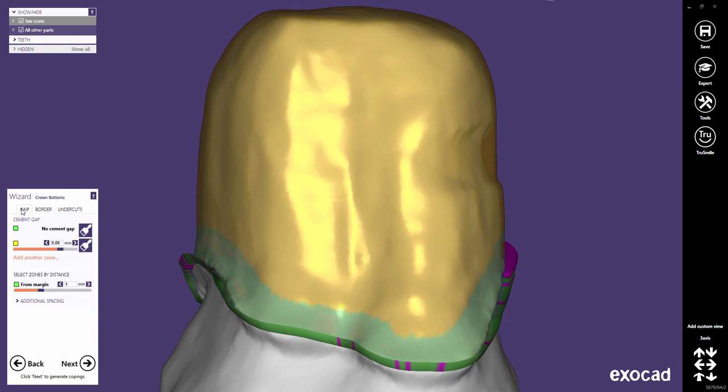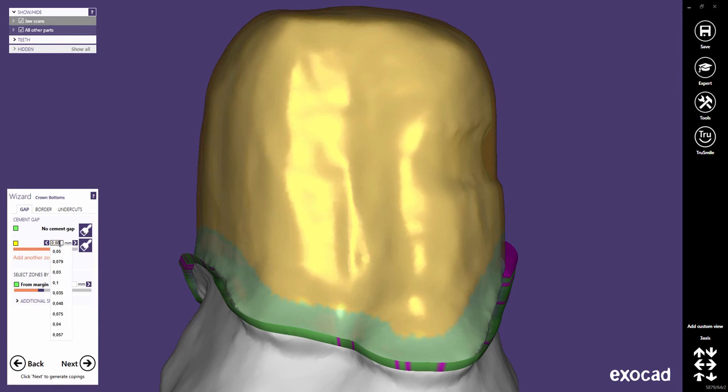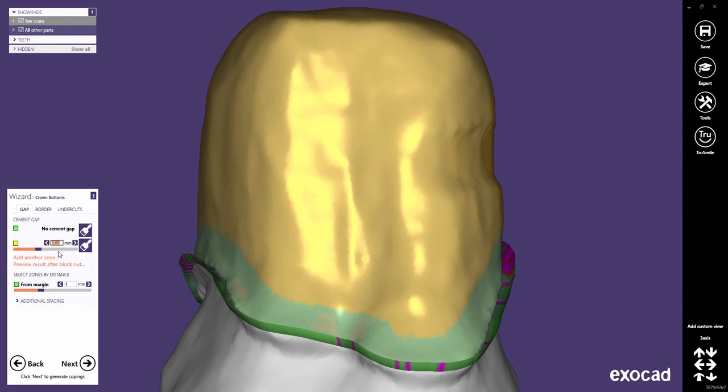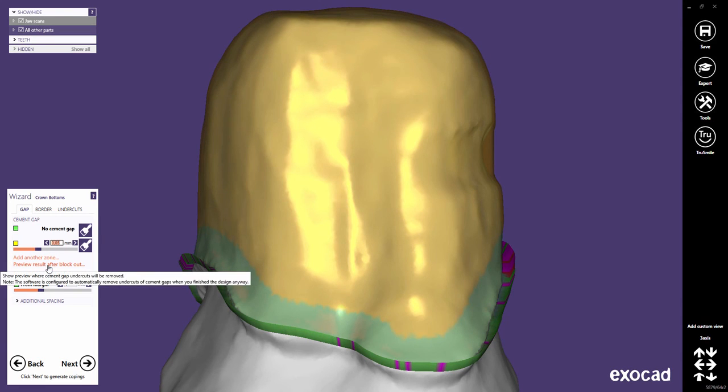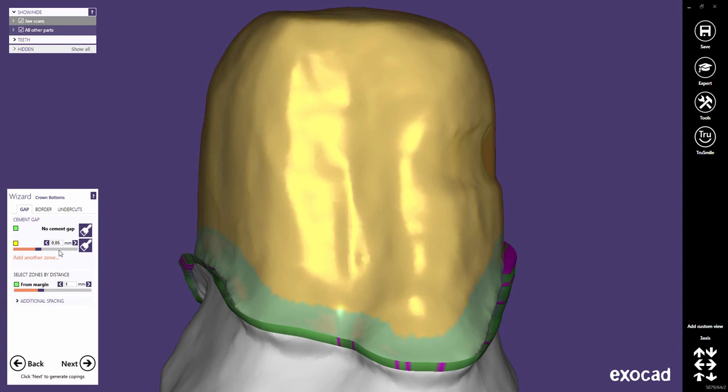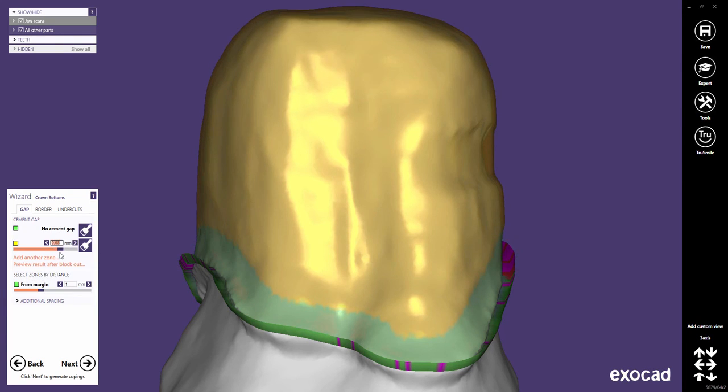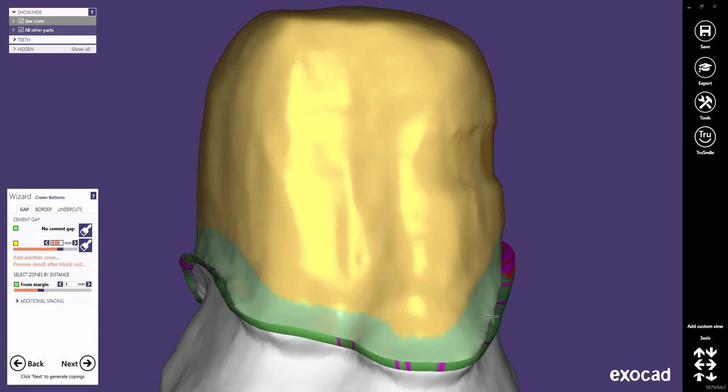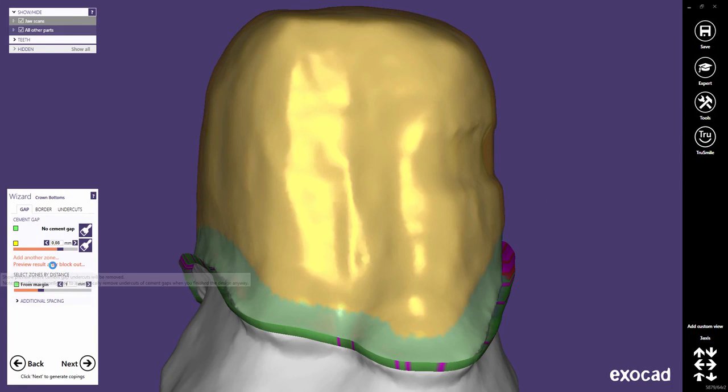Note that computing the blockout of the cement gaps with 3-axis configuration is a computationally intensive operation and cannot be done in real time. Therefore, when adjusting the parameters, you might be prompted to click Preview Result After Blockout to preview the result, including the blockout.